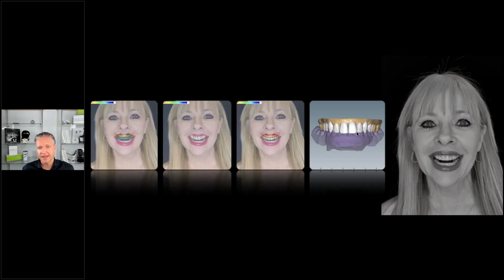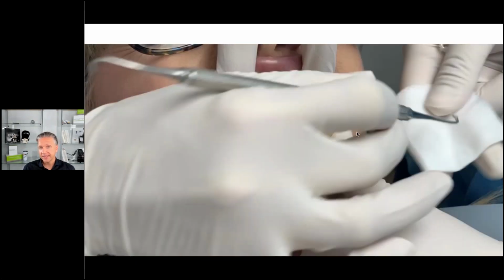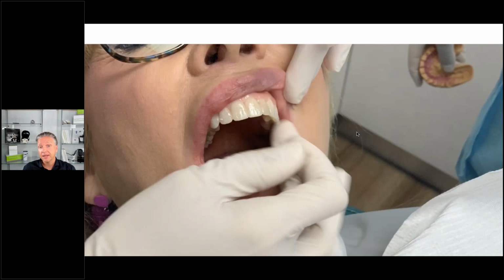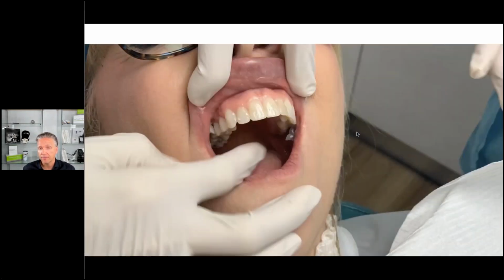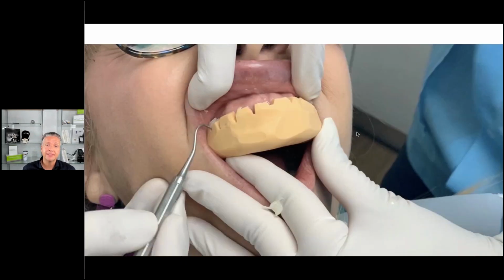So for example, this patient here, you see multiple different colors, different levels of tissue. She's a very unique character, we'll see in a second. And so we had an idea to give her a different smile. So we did the same thing. We did a digital smile design on her, also in 3 dimensions, and created a digital model and a silicone matrix to make a mock-up in the practice. So the doctor here is now able to put our idea of the smile in the patient's mouth with an acrylic-based temporary material, Luxatemp, for example, and can test run the case.